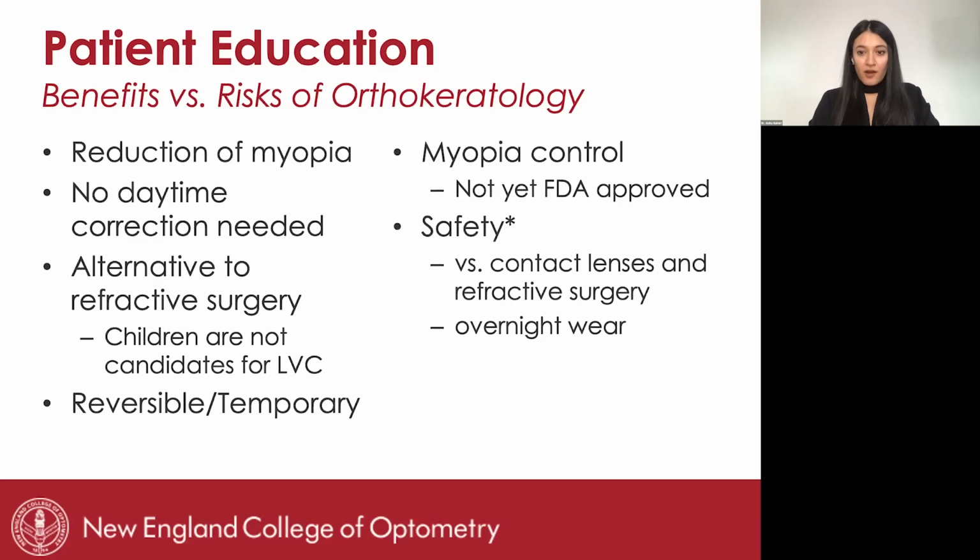Safety of lens wear. It is a contact lens, so it does bring in all the complications associated with contact lens wear, especially when we're thinking about wearing these overnight. Arguably, it can be safer than surgical options, because the treatment is reversible, so that's a good point.